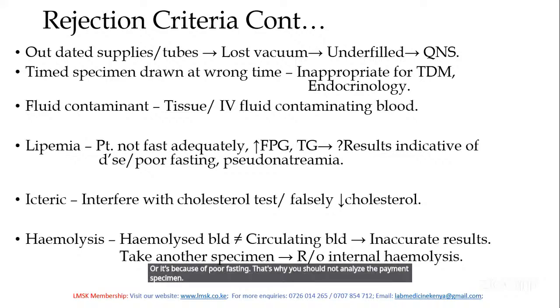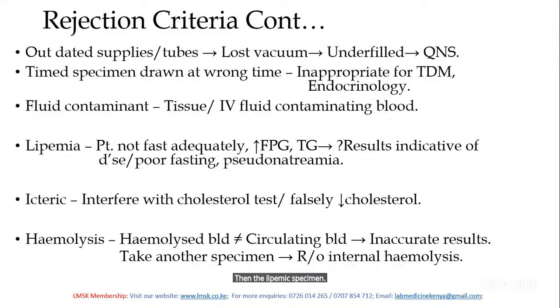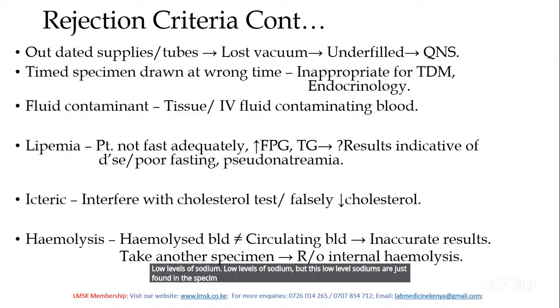Then a lipemic specimen results in pseudonatremia. A lipemic specimen can result in low levels of sodium, but these low levels of sodium are just found in the specimen. It is not a true picture in the body.